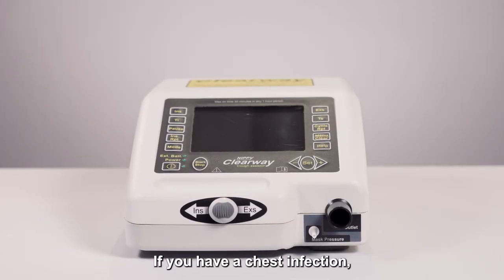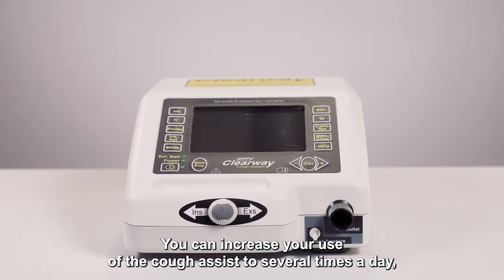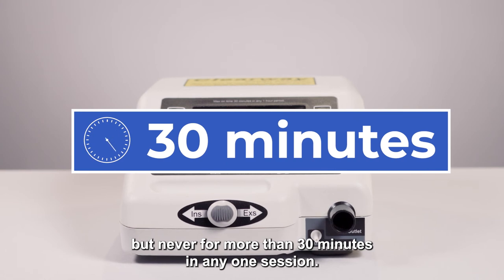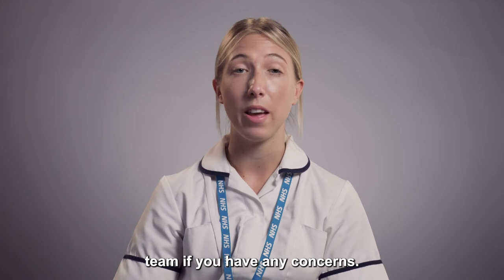If you have a chest infection, it's important you keep using the Cough Assist. You can increase your use several times a day, but never for more than 30 minutes in any one session. Please consult the home and IV team if you have any concerns.